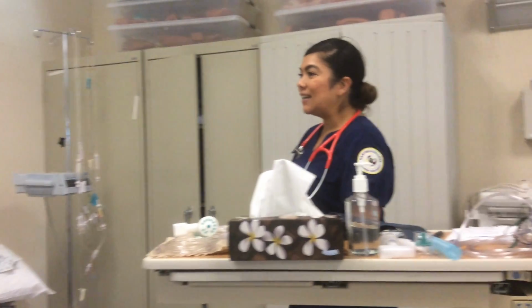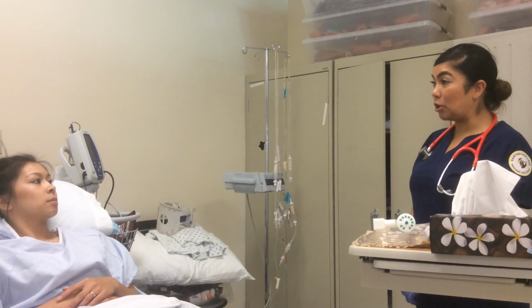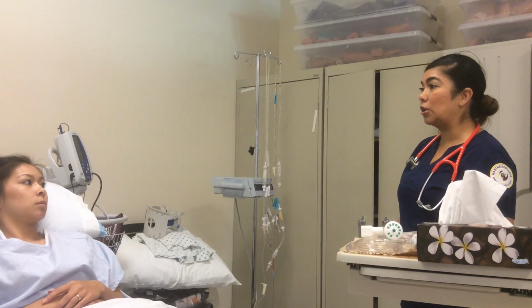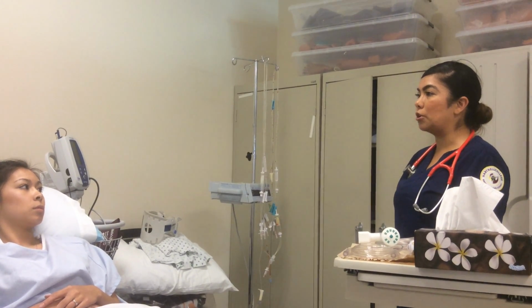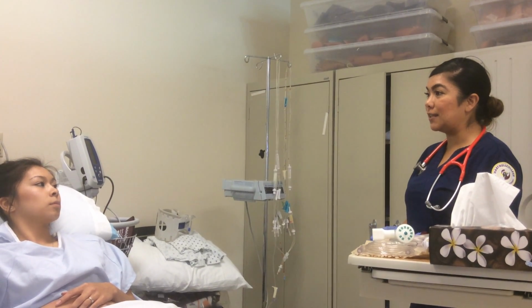Come in. Hello, Miss Adano. My name is Mickey. I'm a respiratory care student from Hartnell College. It looks like the doctor has put in an order for some medication for you. I'm going to go ahead and show you how to use that. Is that okay with you?